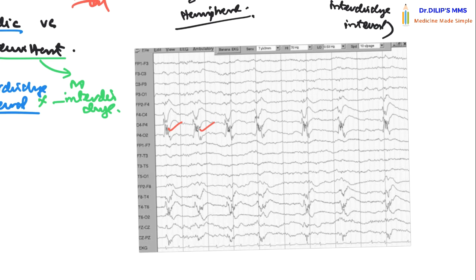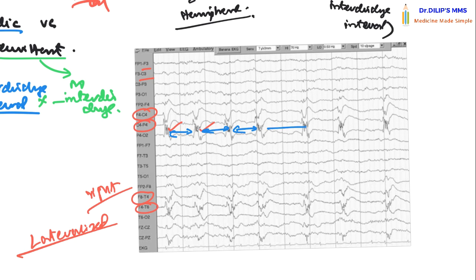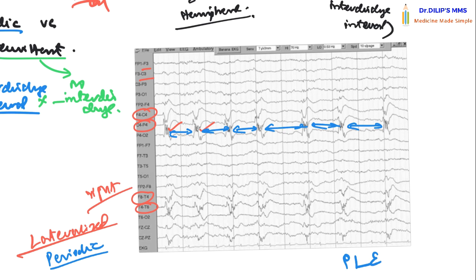In this PLED EEG example, you can see epileptiform spikes that are clearly lateralized — they appear predominantly in the even-numbered leads (right hemisphere) and not significantly in the odd-numbered leads. So first, it is lateralized to the right hemisphere. Second, you can see a nearly regular inter-discharge interval, making it periodic. Therefore, these are periodic lateralized epileptiform discharges.